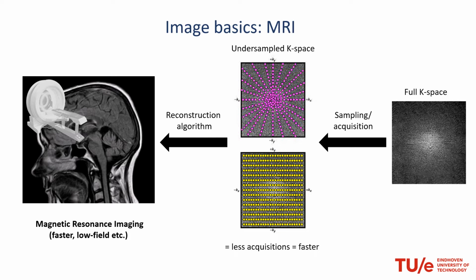In order to do that, you need to add information to this processing chain. In fact, you could formulate this as a couple of problems. So first of all, the sampling, like how should you sample? Well, that's an opportunity for AI. How can we learn how to do our sampling better? How does our measurement model look like, right? It's P of y given x.